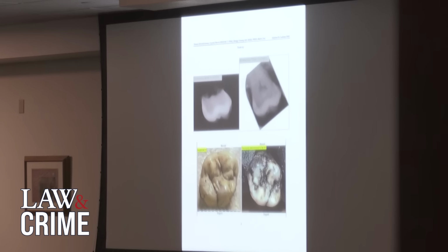And I took then a cropped image of the antemortem radiograph that was taken. I'm sorry if it's a little confusing. The other report had the postmortem image on the right-hand side, and this one I had flipped around, so I apologize for that.